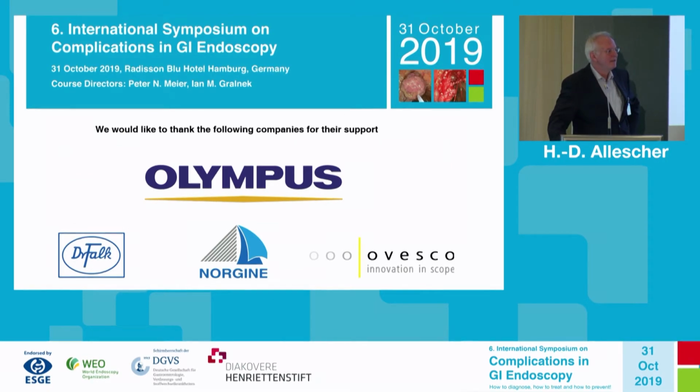And so there's actually 3 steps. At the initial intake of the patient, the nurses then go back over, and then immediately before we drop the scope, the physician, in fact, I've empowered our nurses in our department where it's the nurse that calls the physician who's doing the endoscopy: Professor Grundlich, you need to come here. We're doing timeout right now. And we go through the checklist together, and then the scope is dropped at that point.